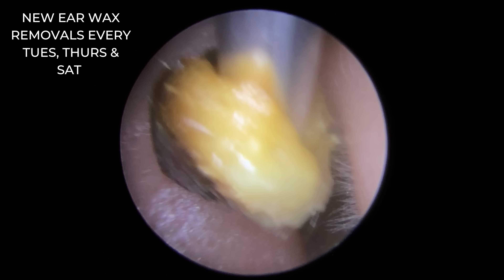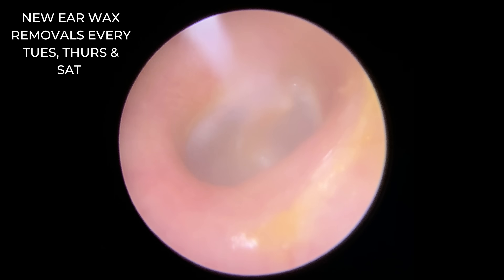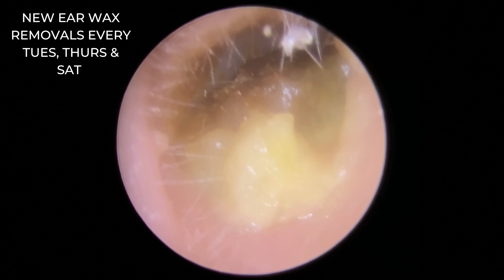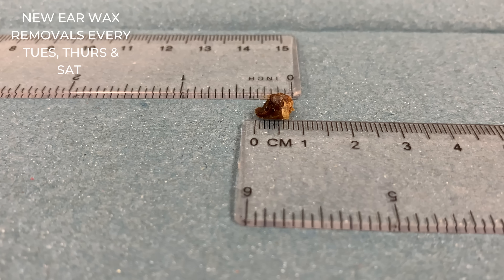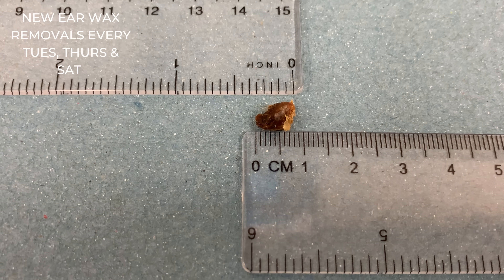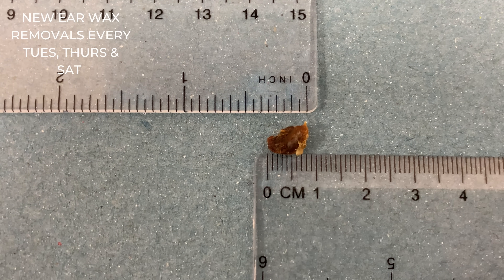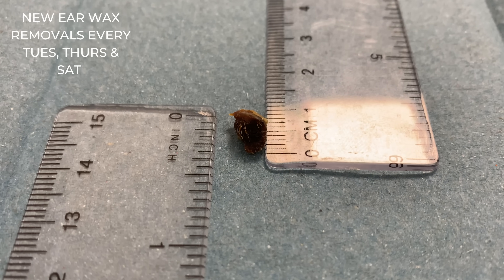There we are — you can see that lighter material at the front, with much darker pieces further in as well. If we take a look behind that, lovely shiny-looking eardrum. This is what it looked like before the patient walked in, and this is what it looks like after. A really tiny little piece, but really causing a few issues. Just under a centimetre, just over a quarter of an inch. You can see that darker section there really clearly.